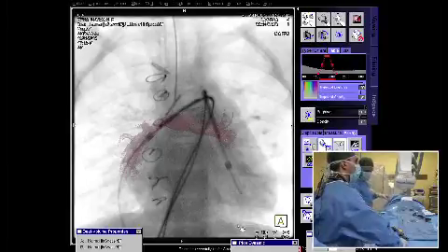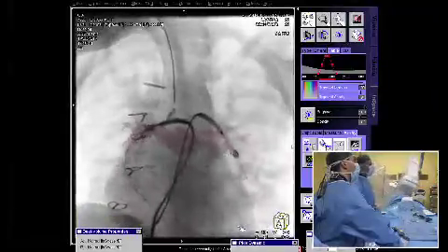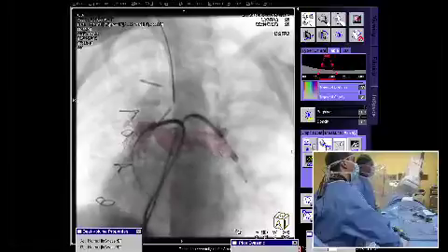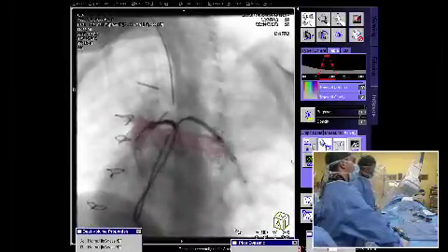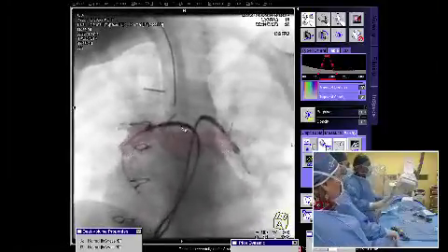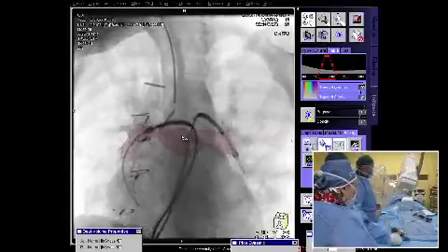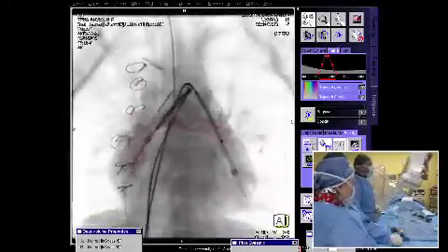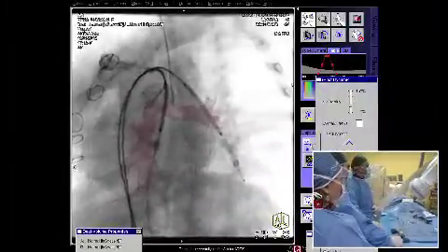Yeah, so what I was going to suggest is the picture that Gianfranco saw, that Philip showed, the very nice left and right. That's probably an angle you can't get in the cath lab. In the Toshiba lab, that number becomes red, which means you can't get that angle. But then sometimes when you go steep caudal, you can actually get both of these. Yeah, that's right. And the road mapping, or iPilot as you name it, is very nice to see.